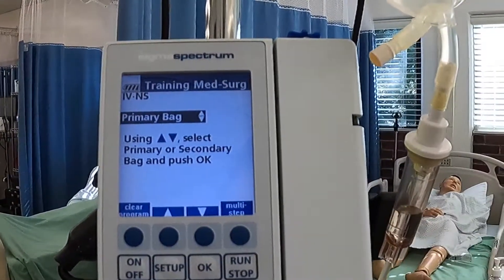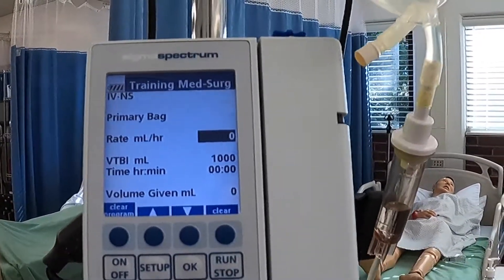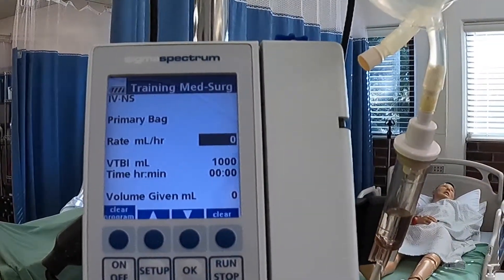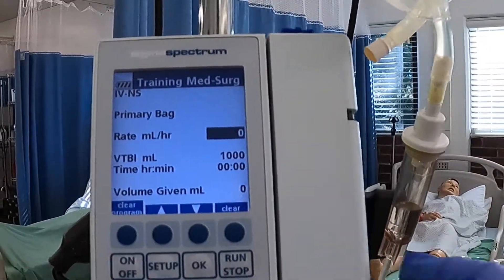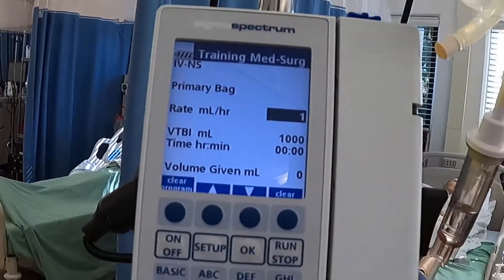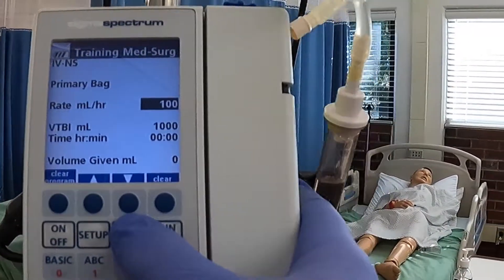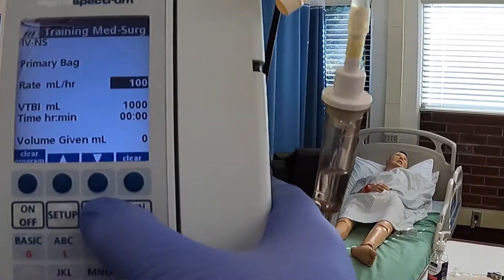Yes, this is our primary bag, so we're going to hit okay. Now, as you can see where that gray box is right here, it's going to ask us what the rate is. We want to make sure we have that same rate that's on our EMAR, which is 100. So I'm going to enter 100 and then hit okay — you need to hit okay on each one of these steps.